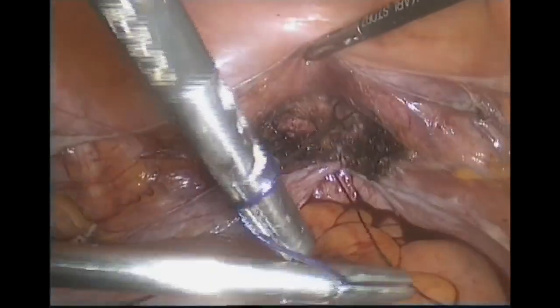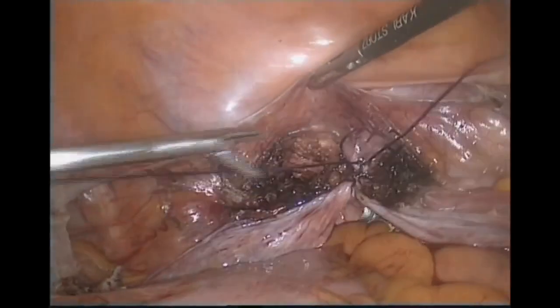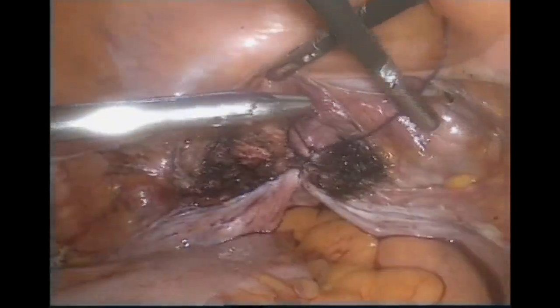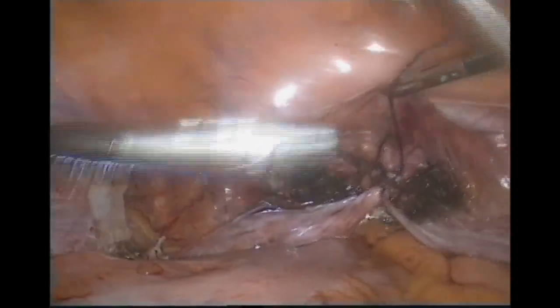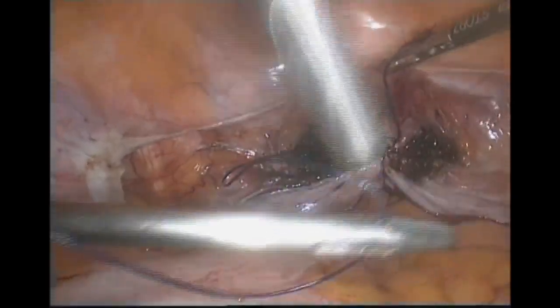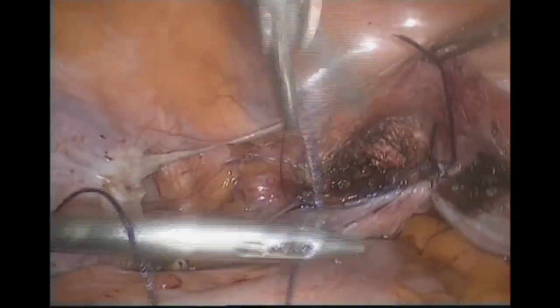To avoid any vault prolapse, closure of the vaginal vault by laparoscopy is safer than by vagina. Regarding the recent published research, done in many patients, laparoscopy had many benefits over the vaginal route.